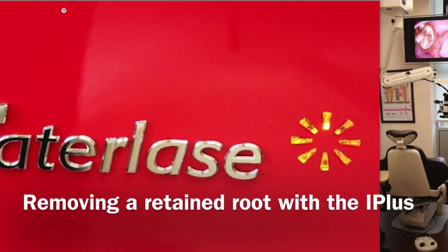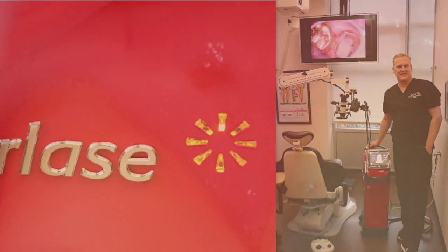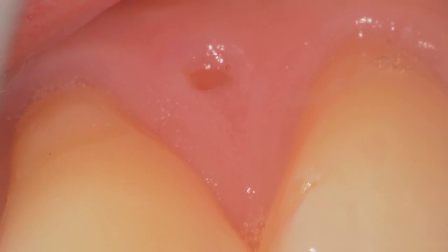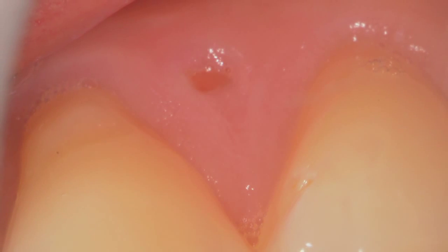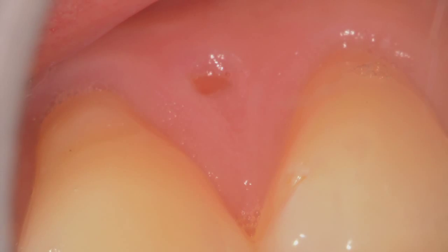Welcome to another edition of Lasing is Amazing with Dr. Glenn Vanass. Today we're looking at a retained primary root. A patient who is about 31 years old came in with a spot — they noticed something hard on their attached tissue in the upper right premolars.